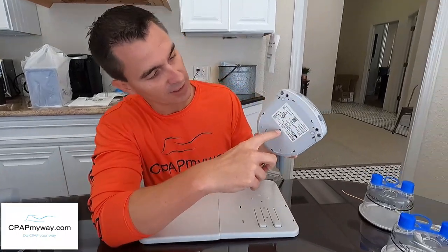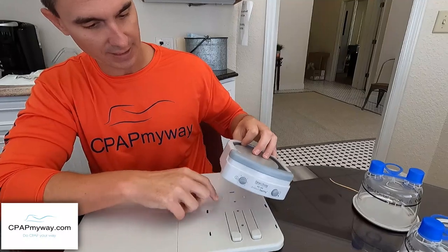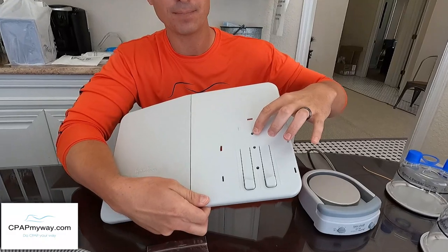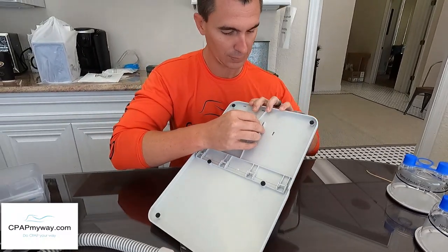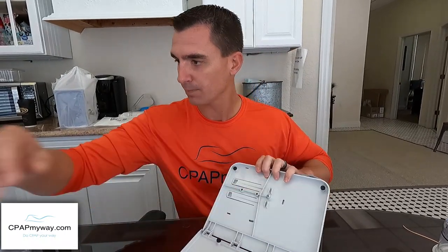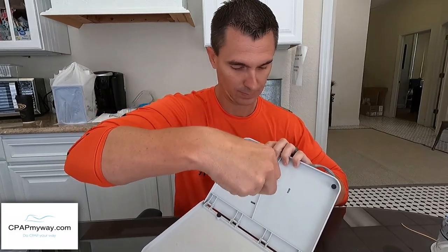Next you want to install the heater plate, best done without the chamber in there — just slide that out. On the bottom of the heater plate there's a little screw hole. You're going to line that up with the furthest hole on the tray, pop it through — it's a Phillips head — and tighten it up. That will hold the tray in place.